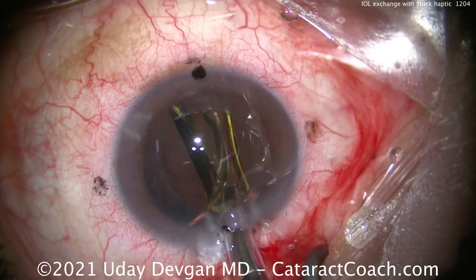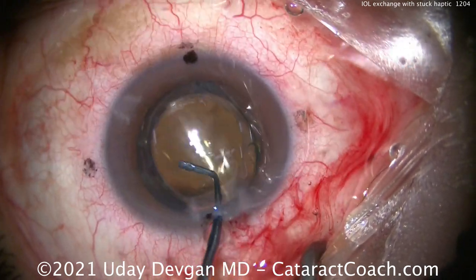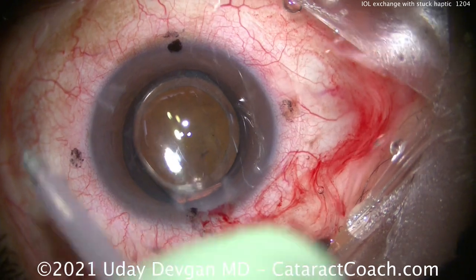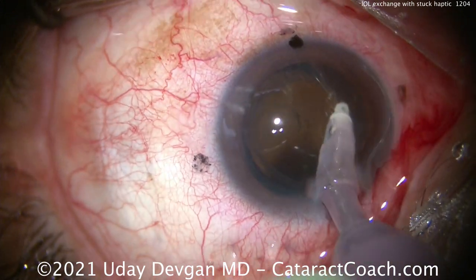Putting that new monofocal lens right back into the capsular bag, aiming for plano. Letting those haptics open up and that lens will center beautifully. Now time for the eye probe going inside the eye — be delicate here. The capsule is really wimpy.